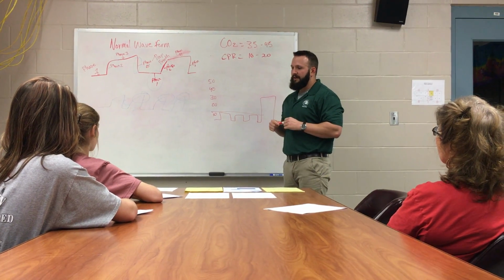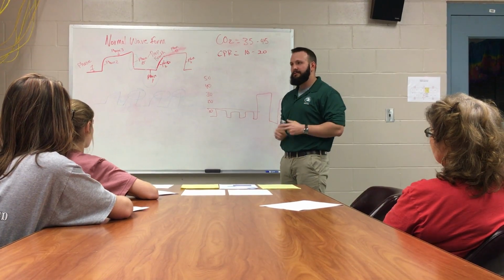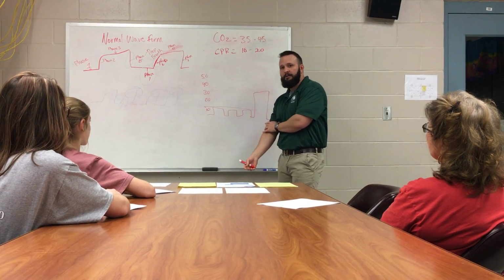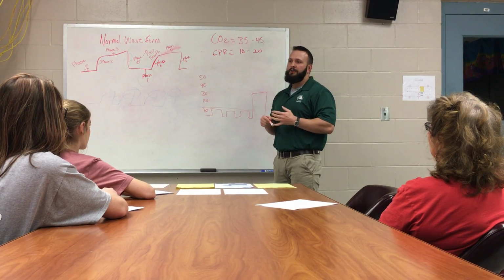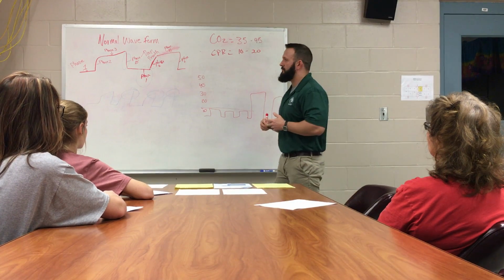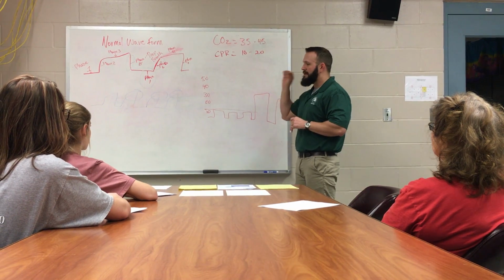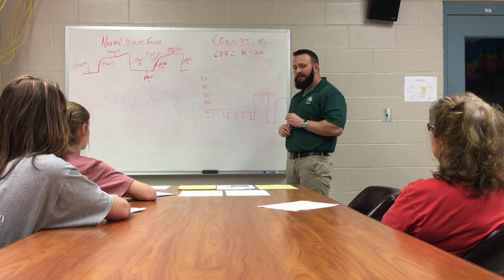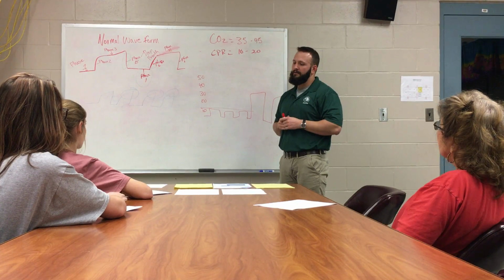End-tidal CO2 is a very easy thing to monitor. You have to have the correct equipment. That is the drawback. It used to be pretty expensive. Now it's becoming a standard of care, so the price is coming down. You're starting to see it now in all your EMS services. You're starting to see it in your ERs and ICUs and CCUs. And this is the best thing that you can have for your patient, because it's literally giving you a live action shot of gas exchange to your tissues. And if we can keep you oxygenated, we can keep you perfused, it's the best possible outcome for your patient.